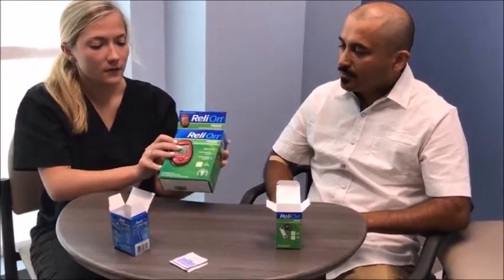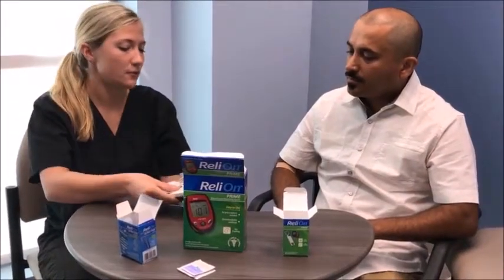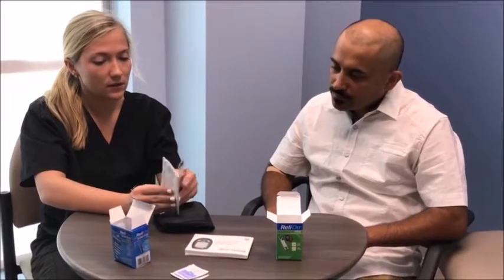The whole kit comes with instruction manuals if you need additional help. It also comes with a glucose logbook. In this logbook you put the date, roughly what time of day you checked your blood sugar, what it was, and whether you gave medication if it was too high. This is really important because it helps your doctor track how well your diabetes is being managed and how well your blood sugar is being controlled.